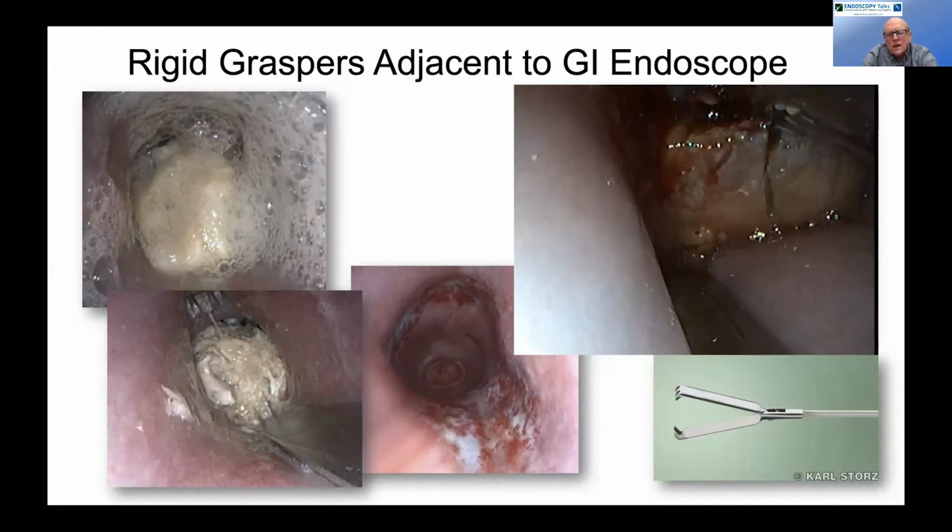I generally get very concerned if I see transmucosal ulceration going into the submucosa greater than 180 degrees circumferentially around the esophageal lumen. I think those are the cases that I generally warn the owners of a potential esophageal stricture formation.